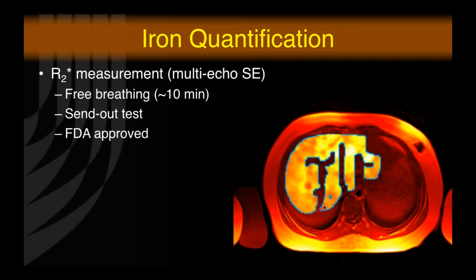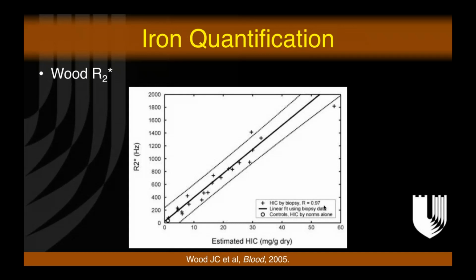The downside is that there's an additional charge. It's a send-out test, so you have to figure out the data transfer, and it does take a good 10 minutes to do. That's the R2 side of things.